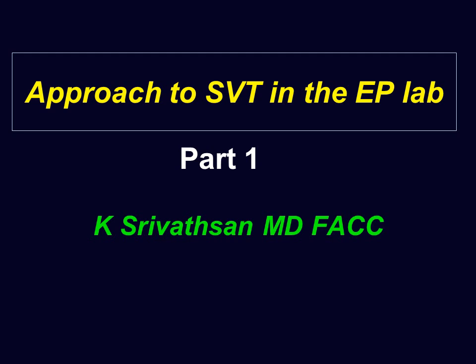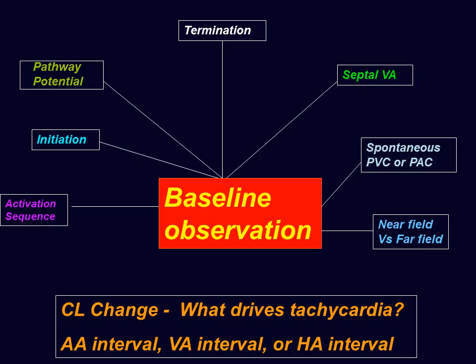We'll talk about the approach to SVT in the EP lab. At baseline, observations such as initiation, termination, septal VA interval, spontaneous PVC or PAC, and how it disturbs the tachycardia. The activation in the atrium may give a clue.